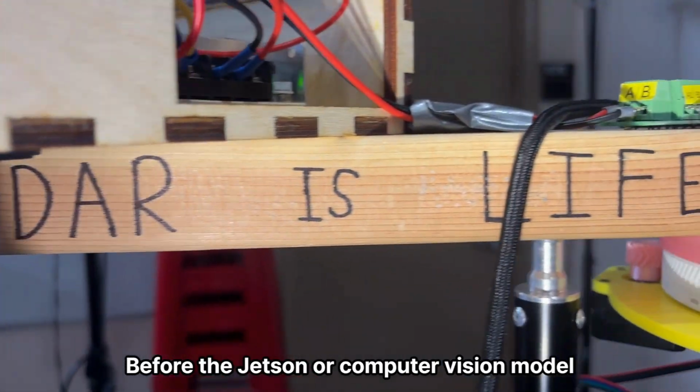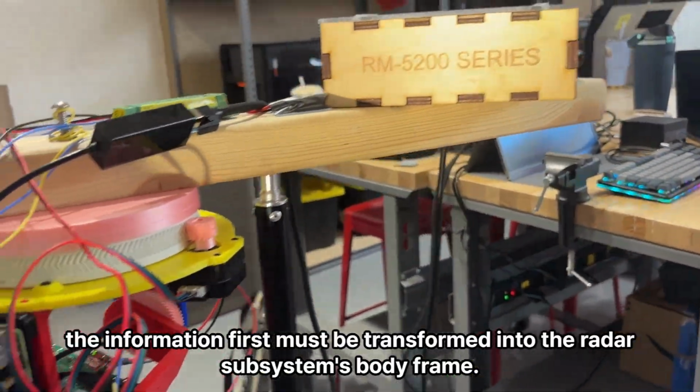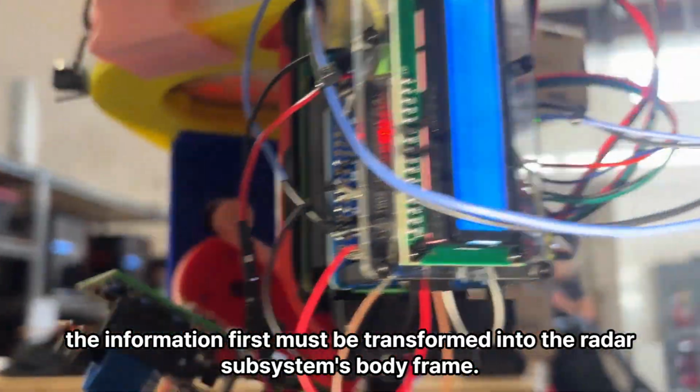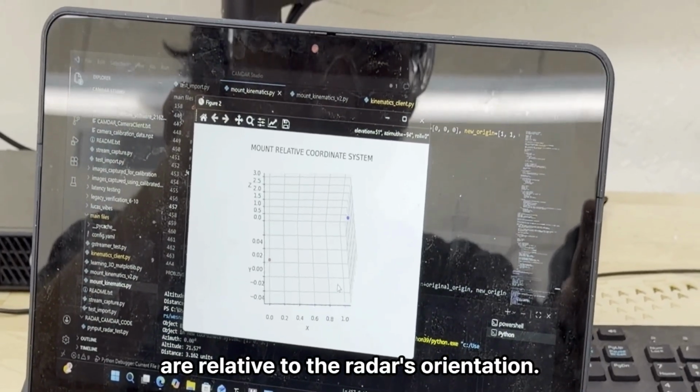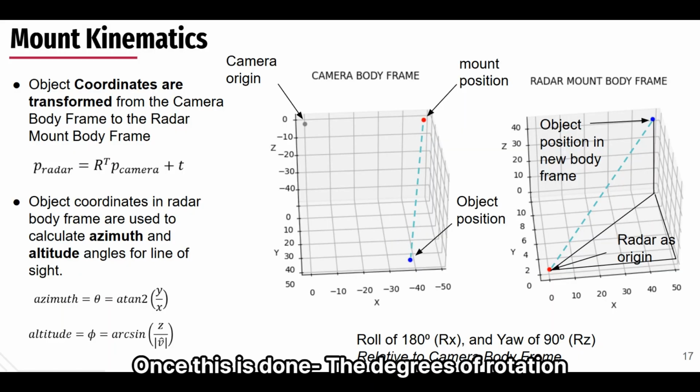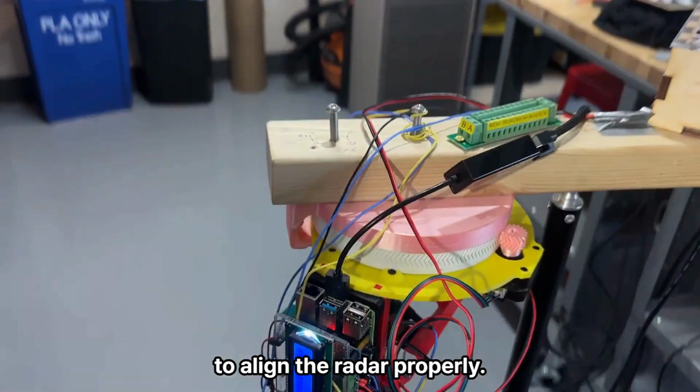Before the Jetson or computer vision model sends the 3D coordinates of a compromised individual, the information first must be transformed into the radar subsystem's body frame. This is done to make sure the line of sight to the target coordinates and associated angles are relative to the radar's orientation. Once this is done, the degrees of rotation in altitude and azimuth are calculated for the relative coordinate to align the radar properly.